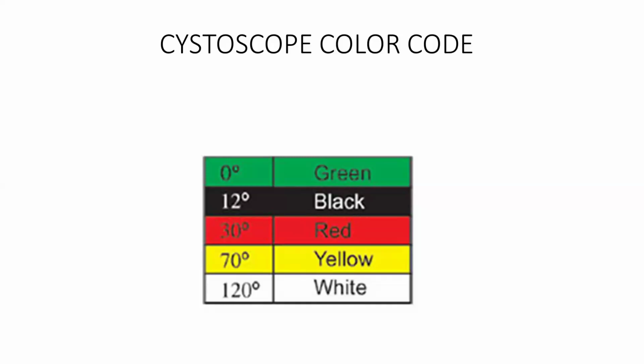So exactly what you are saying. If it is a 30 degree, then down 30 degrees is the center. 60 above that means from 0, it will be only another 30 degrees. And down it will be 30 plus 60, so it will be 90 degrees. So total will remain 90 degrees. Correct. Yes.